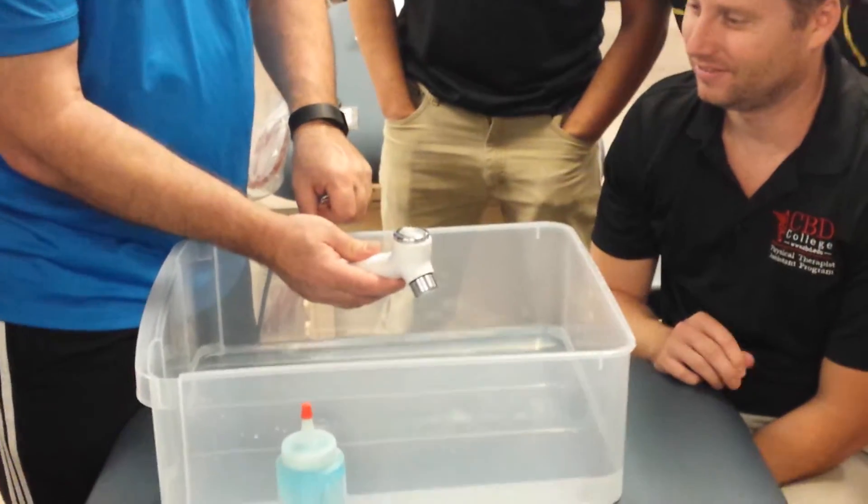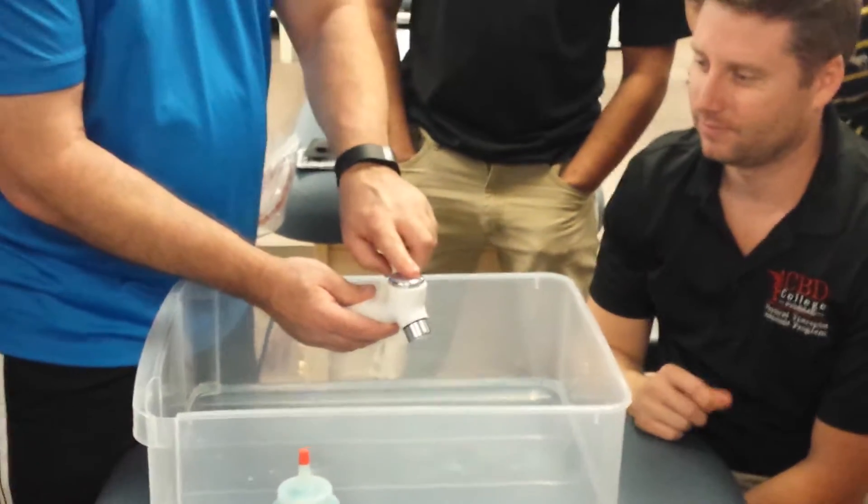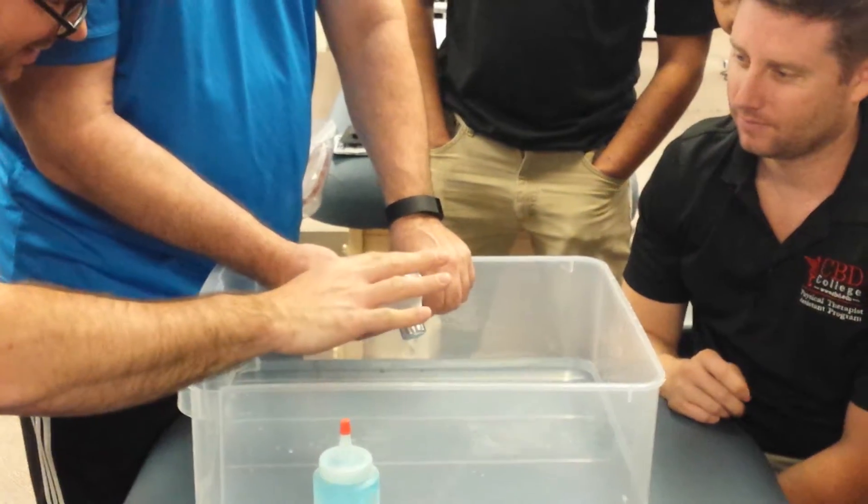But it's not hot. It's not hot too. I mean, if you leave your finger on there it gets hot.